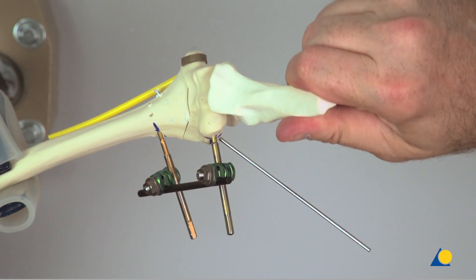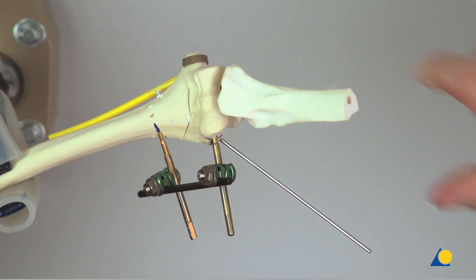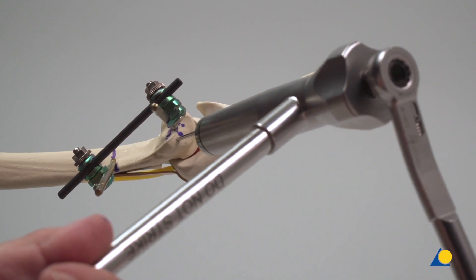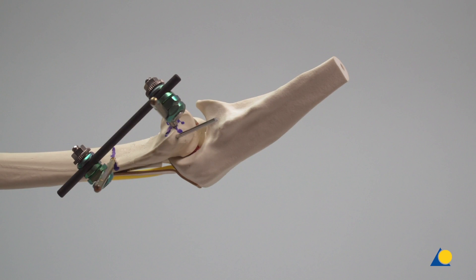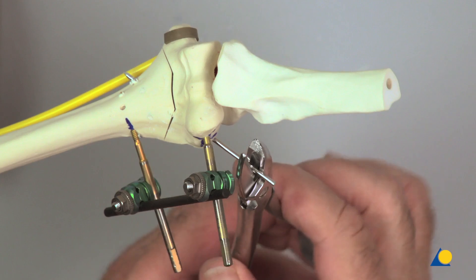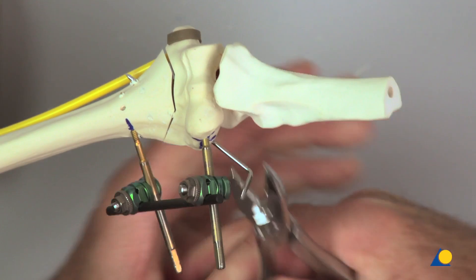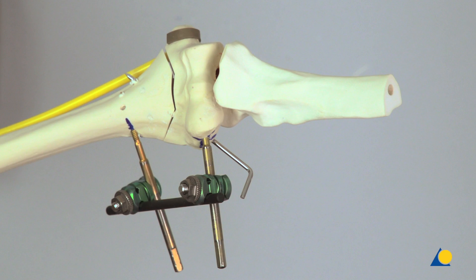The distal fragment is well secured and can no longer be rotated. In this exercise, the K-wire is trimmed using the cutter for titanium elastic nail, but usually it can be trimmed with an ordinary K-wire cutter. The protruding end of the wire is bent towards the fixator. This prevents patient soft tissue injury in the post-operative period.